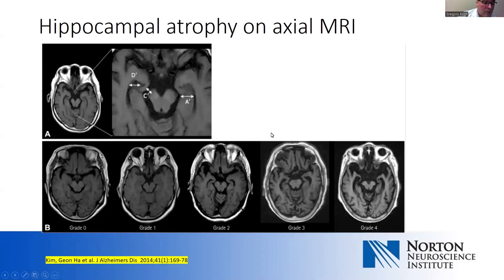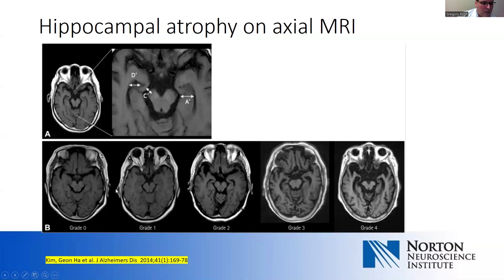Unfortunately, if we just ask for an MRI, we don't always get coronal slices through the hippocampus. So we may need to look at axial slices to get a sense of hippocampal atrophy. There's a scale that correlates very nicely with the medial temporal lobe atrophy scale. Looking at hippocampal structures at the level of the midbrain, you get a sense of progressive increasing hippocampal atrophy. Many scans are read out as normal age-related atrophy, but in the setting of someone presenting with memory problems, this can represent quite profound hippocampal atrophy.